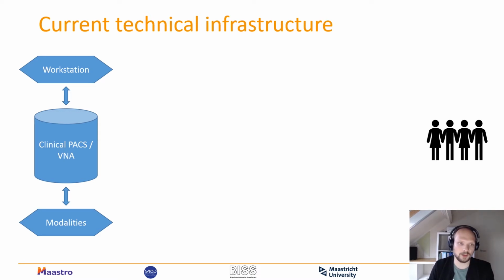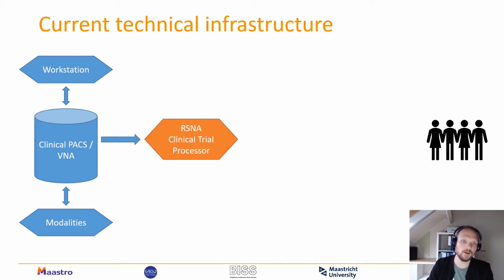First of all, we're using a component called the Clinical Trial Processor, or CTP for short, developed by the RSNA, the Radiological Society of North America. It is a rule-based tool which can de-identify the metadata part of the medical images: the patient identifiers, the doctor identifiers, information about the modality settings, such as what voltage was used for a CT scanner, or the radiotherapy dose.